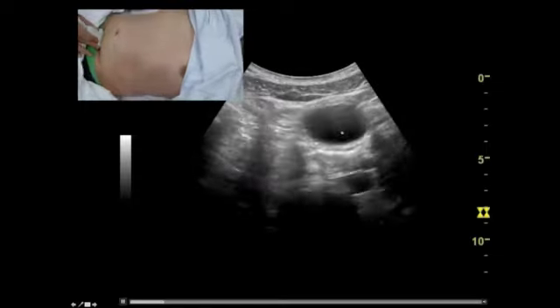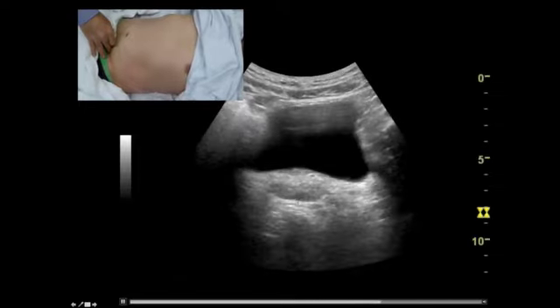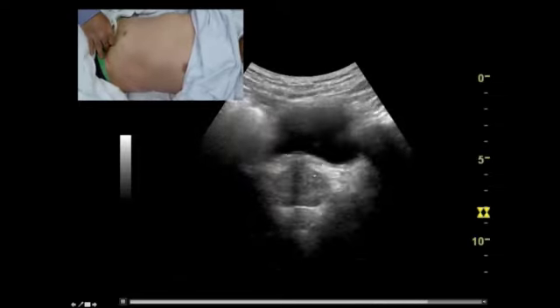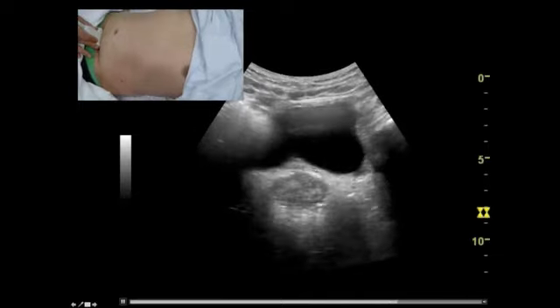Okay, so now we're going to start at the top again. Here, iliac vessels on the side. This is the bladder. We're going down, down, down. Now we see the bow tie shape of those seminal vesicles. We come down further. We're down at the prostate and right down through the bottom. We're going to see the ureteric orifices just about here. They're very hard to discern, but those little tubes going in there are the ureteric orifices.